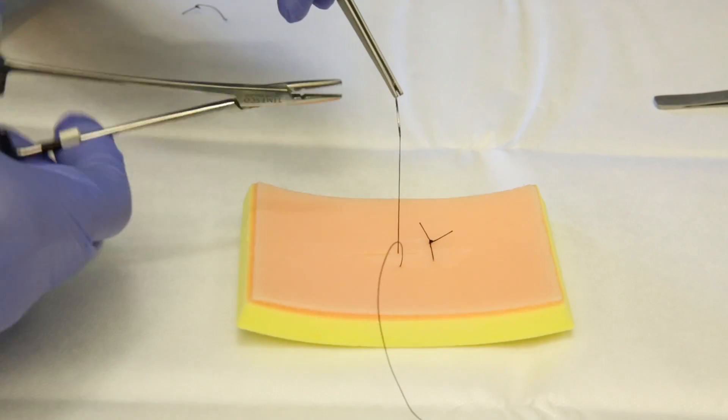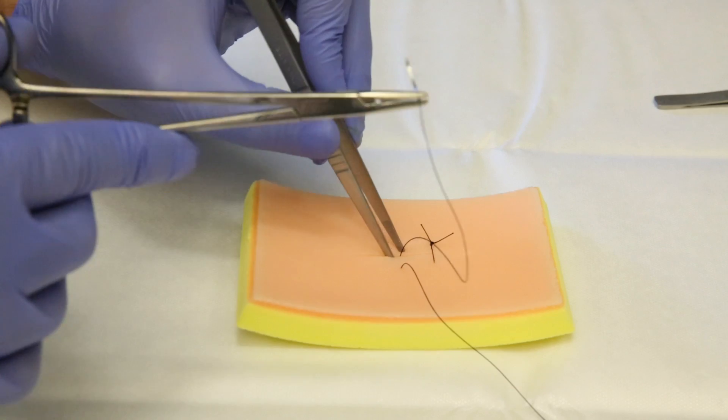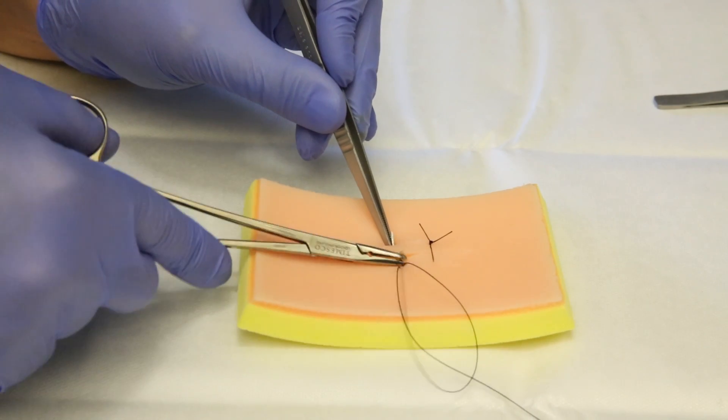Coming from the skin, out from the wound, back again through the wound, out of the skin from the left side.